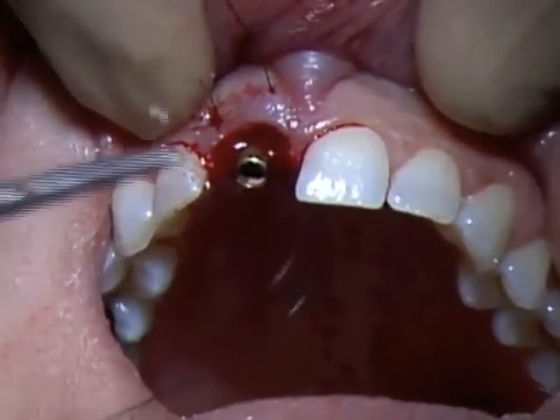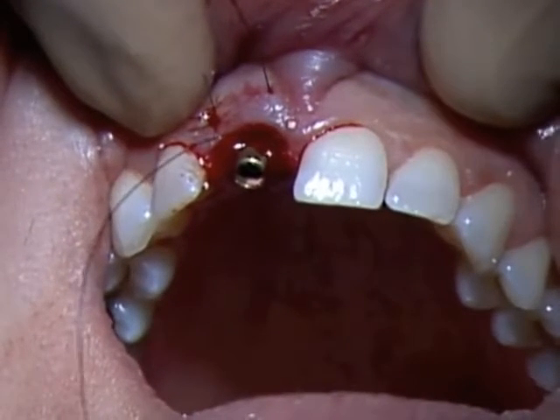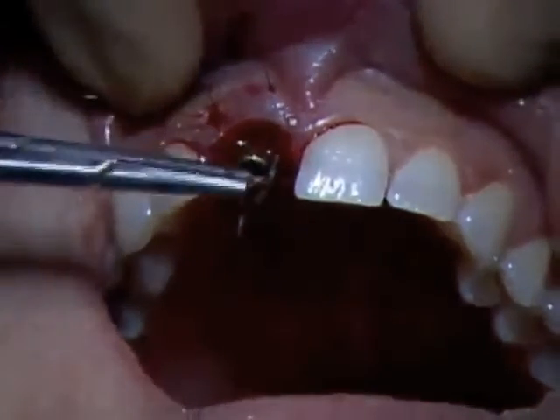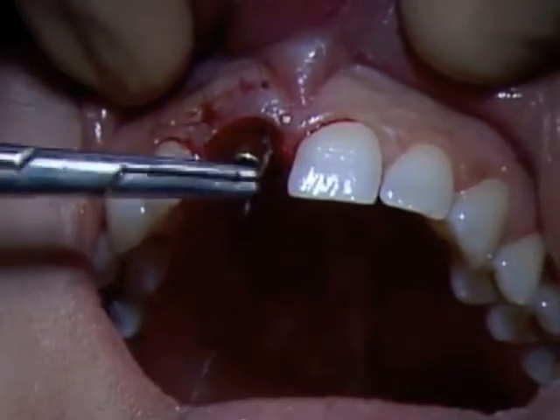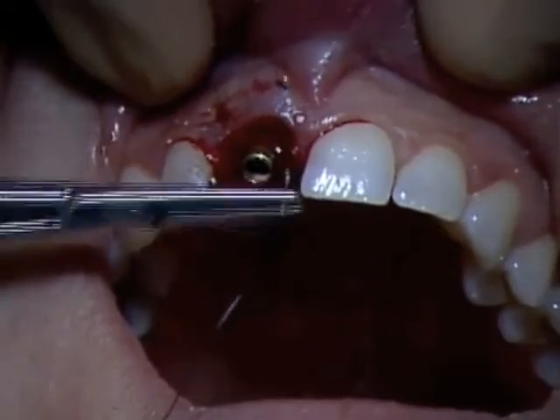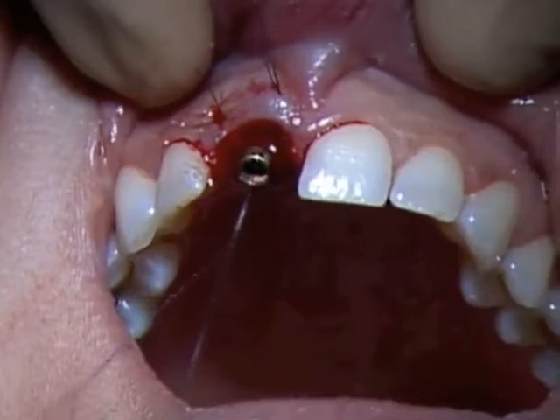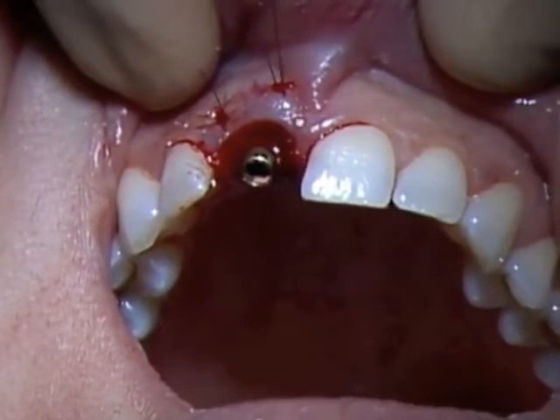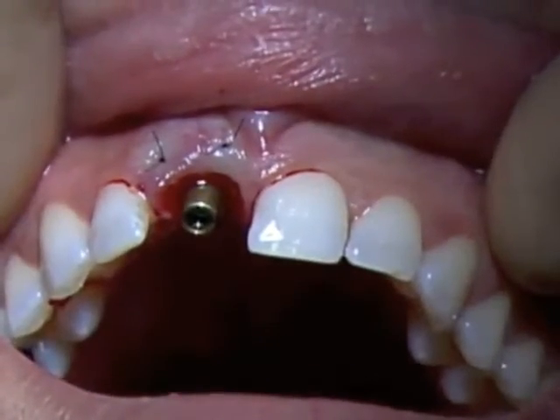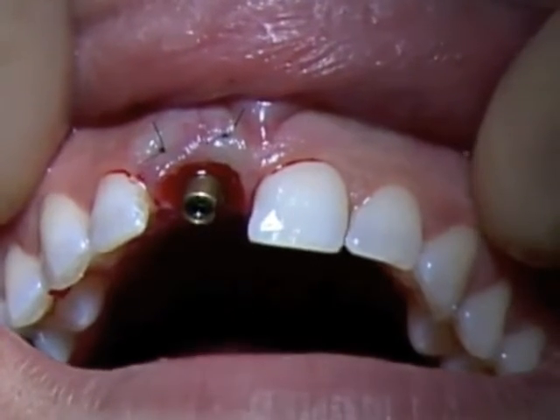We will create a small gap in between the free gingival margin and our abutment, which will seal and close in a matter of hours. So this is not a problem. You see here we will go out almost in the same position we entered from the buccal aspect, and finally we will keep the area sealed and maintain, as we see here, a sound soft tissue architecture.